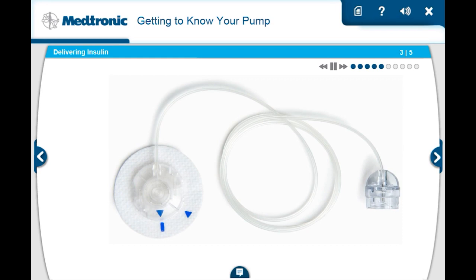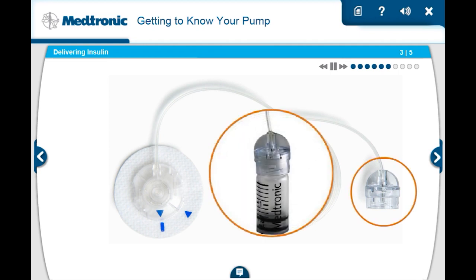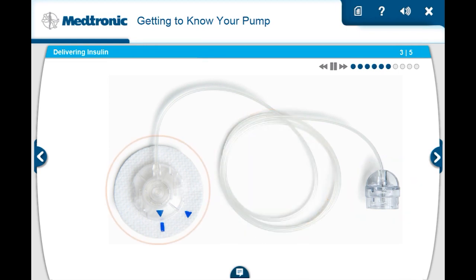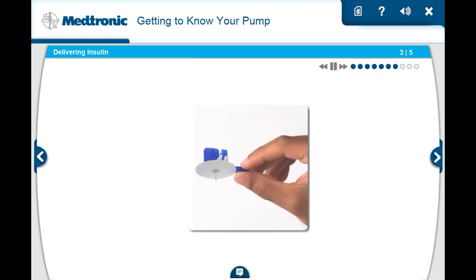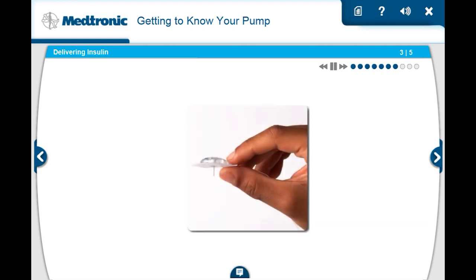The infusion set is the tubing connecting the pump to your body. There are several different kinds of infusion sets, but they all work the same way. In this example, we're showing the quick set. One end of the infusion set connects to the reservoir, and on the other end is the insertion site section. This end uses a very small insertion needle to guide a tiny tube called a cannula into your body. After it's inserted, the needle is removed, leaving just the flexible cannula behind.